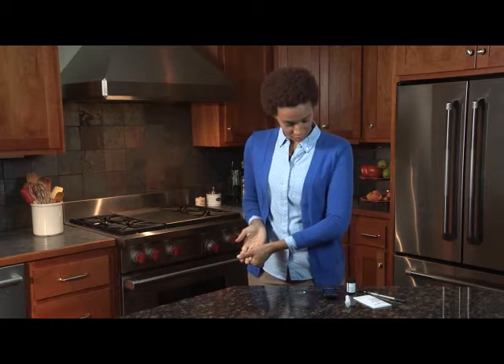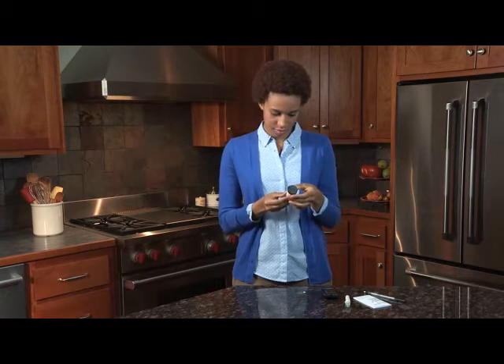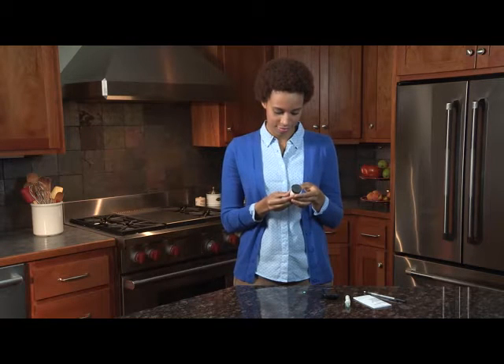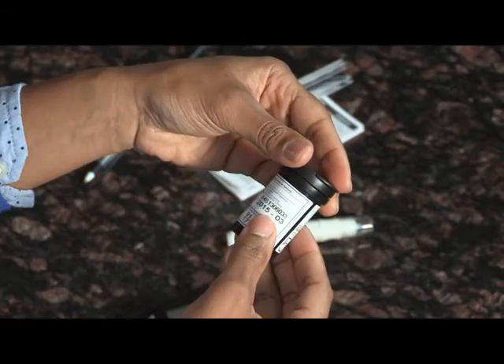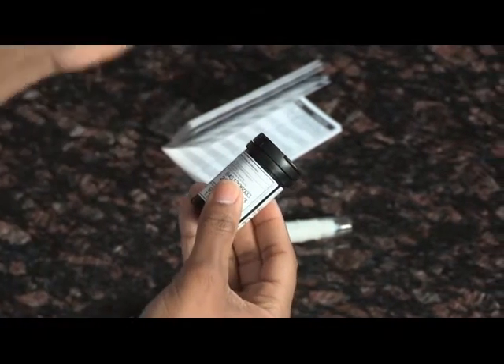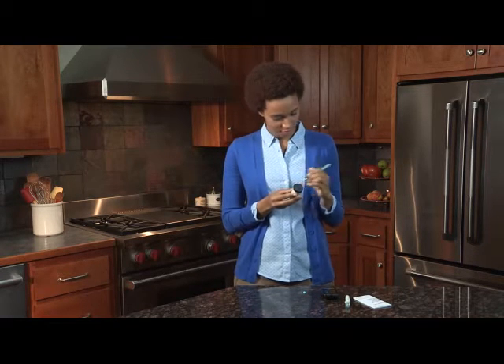Before performing a blood glucose test, check the expiration date printed on the test strip bottle. Do not use expired test strips. When opening a new bottle of test strips, record the date opened on the bottle label. Discard the bottle and any remaining test strips after 3 months from the date you opened the bottle.